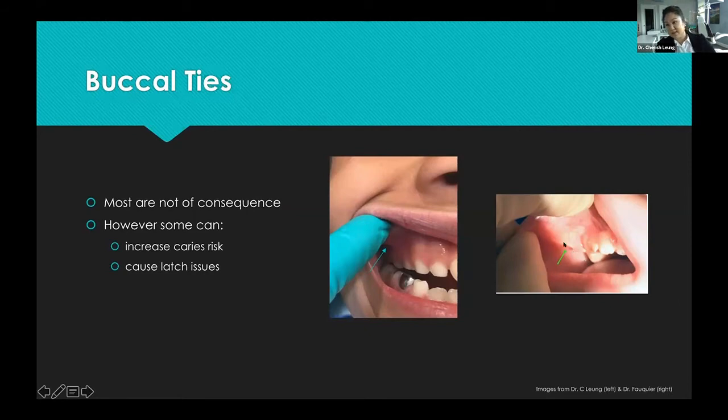This one here you can see is really, really good, but you can still pull the cheek out, so probably not an indication to treat it, and this one has a little tissue tag on it. That can happen sometimes too, especially if they fall and sever their frenums, but not all the way. It can get a little tissue tag on it. Not really a huge deal, but just something to be aware of.